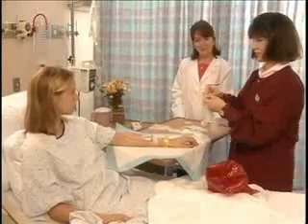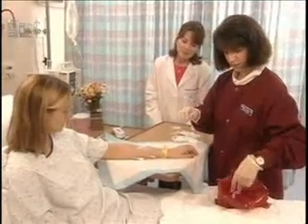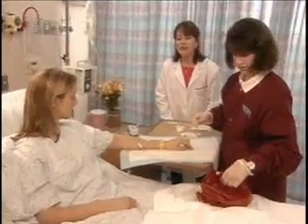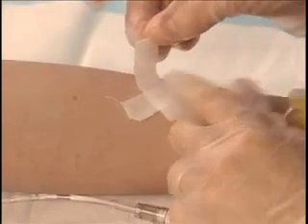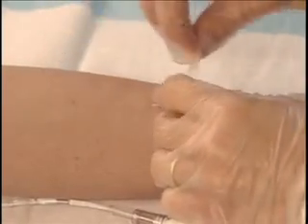Now we can get the dressing off. Be sure to leave the tape that anchors the IV catheter in place, Jeannie. Okay. Now, when you loosen the tape holding the catheter, be sure to use your other hand to hold the catheter in place, okay? Do you need an adhesive remover? No, it's coming right off.